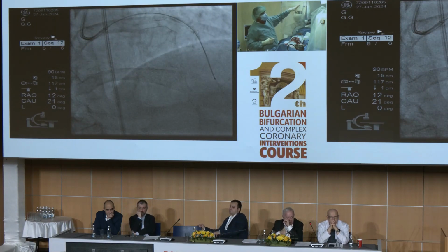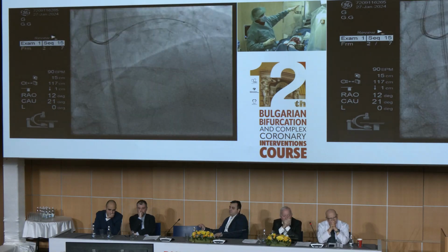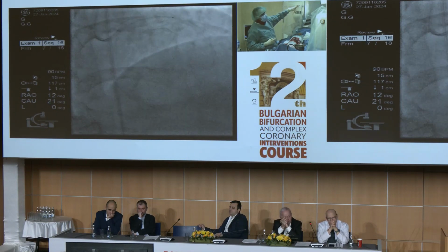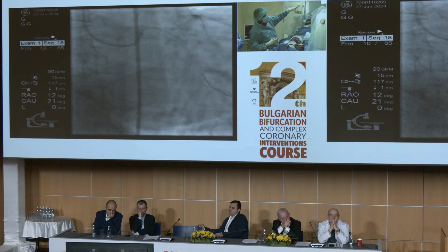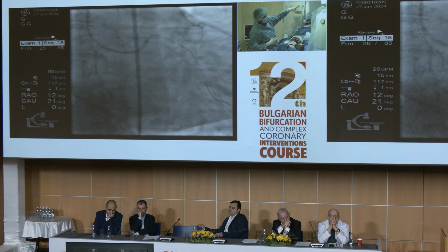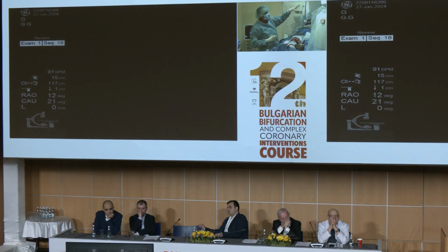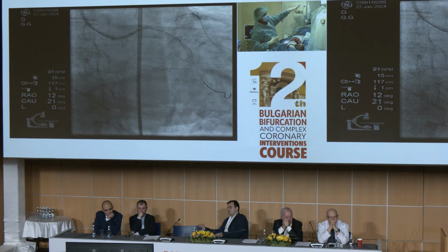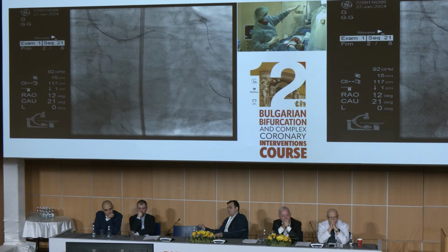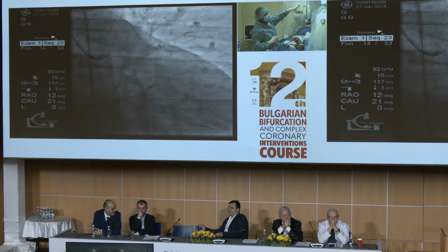We made IVUS several times in different segments. We made IVUS in the LAD, and we made IVUS in the circumflex. It was a little bit difficult to introduce IVUS, and the results from IVUS, Eva will show you. She is now our IVUS woman for this session. So she is behind me.